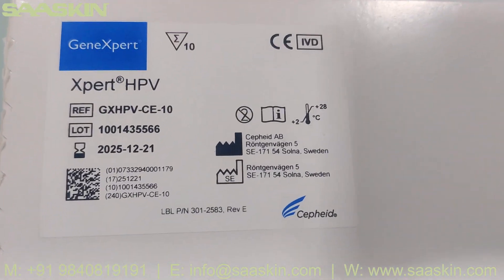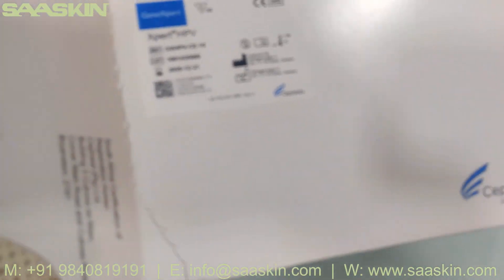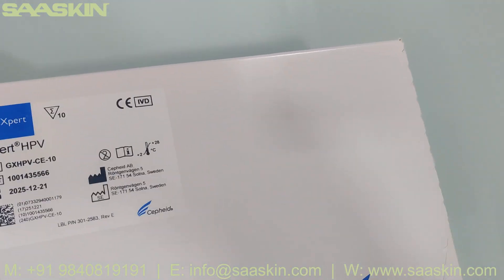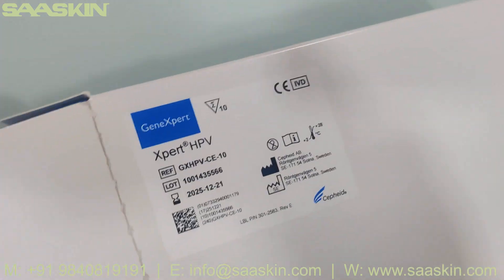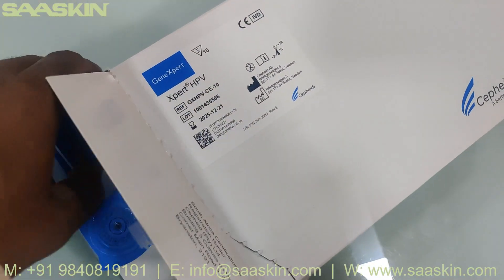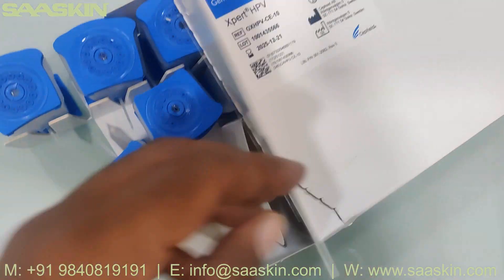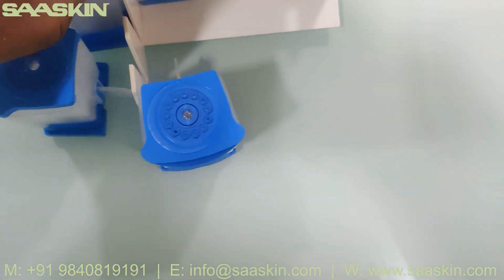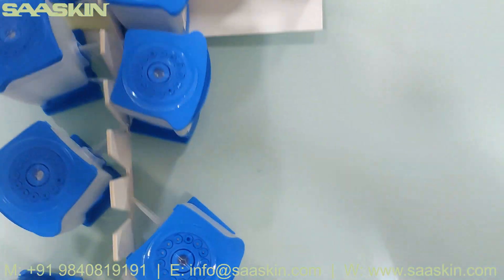I am going to unbox this for you. You can see there are 10 cartridges — all 10 cartridges inside.